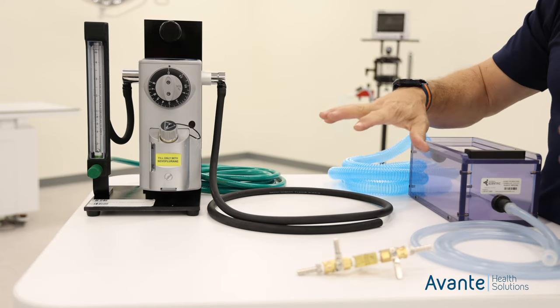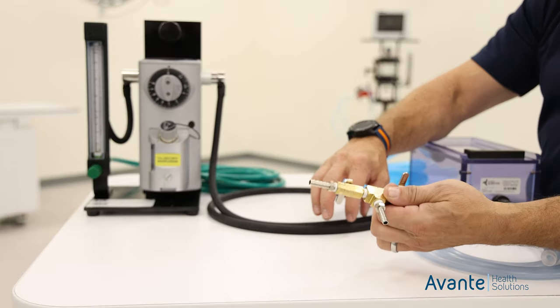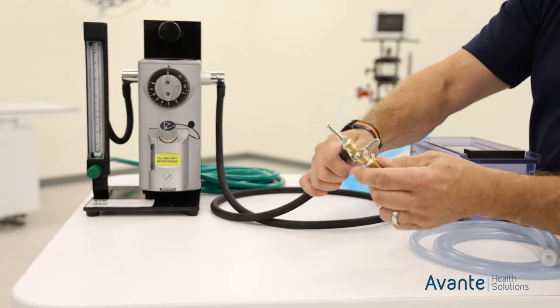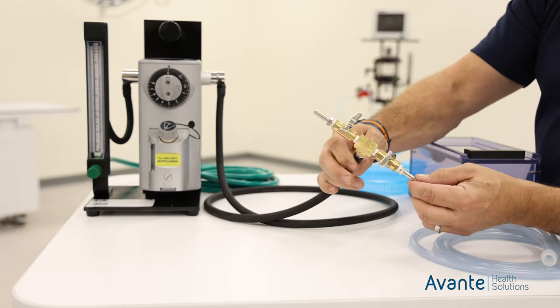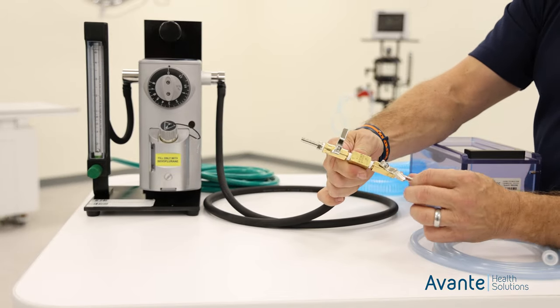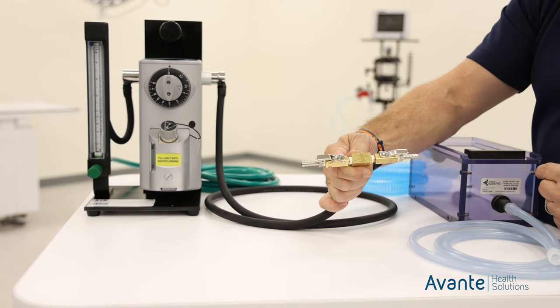This is where things are kind of different depending on the configuration. If we get a multiple induction chamber system, our main gas will go to the line. To turn on, we just simply put the handles in line, and that tells us that the gas is flowing.